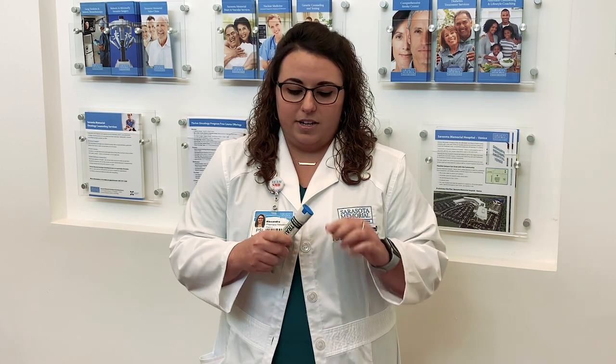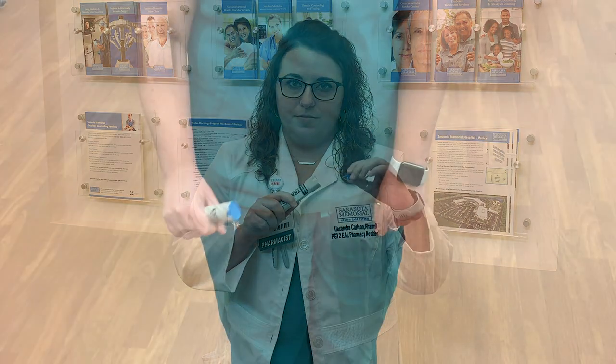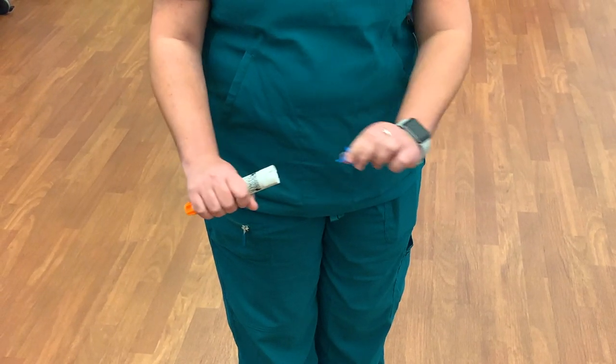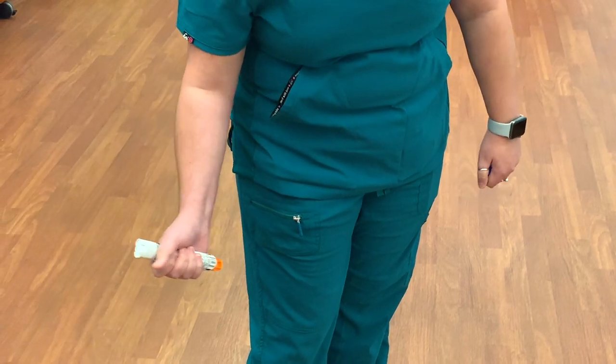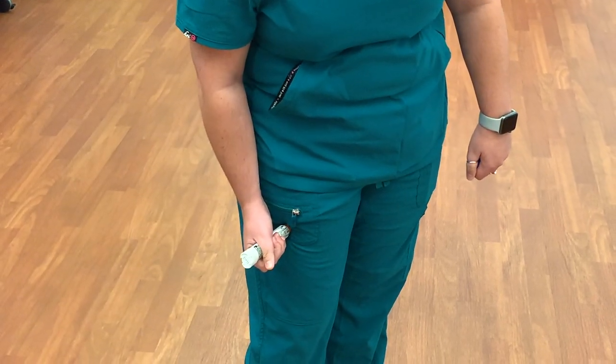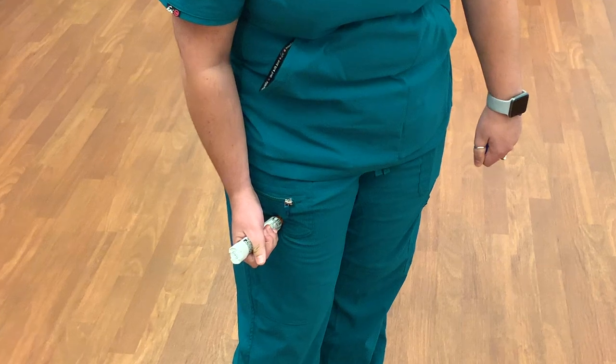So how to use it is that, regardless of which one it is, you're going to have to take the top off. And then you're going to have to administer it into your leg. When you do, you're going to have to use some force and push down into your thigh muscle. And you will hear a click.